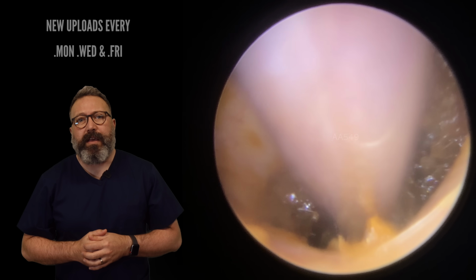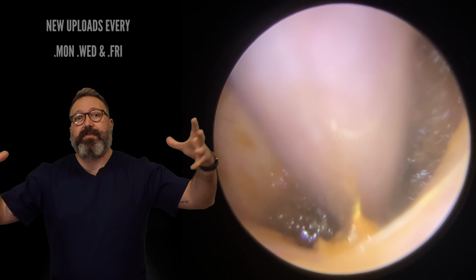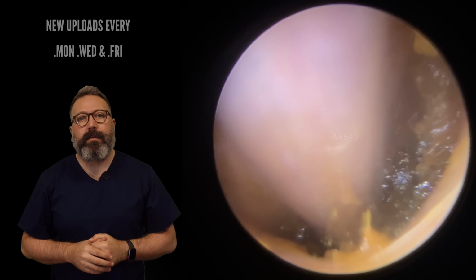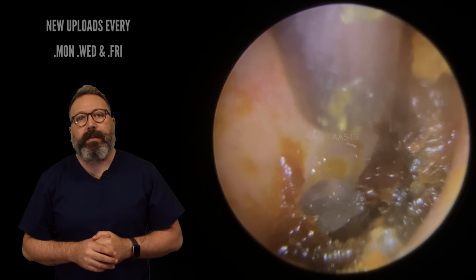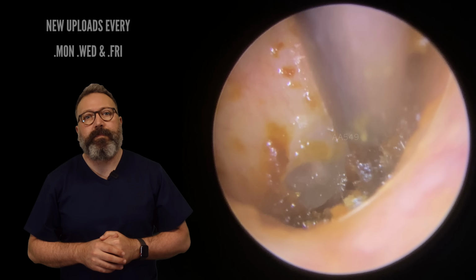It's really kind of having to work hard. You can actually see this suction tube, you can see the wax just kind of getting drawn into the center there. There we go. Oh, now we're starting to see a lot more of the eardrum. You can see how it's really starting to uncover the drum now.